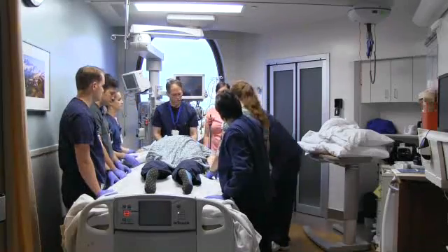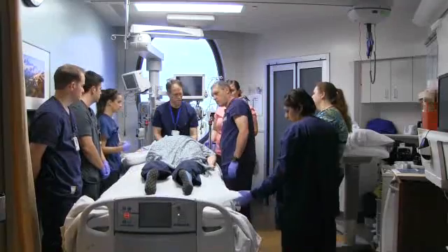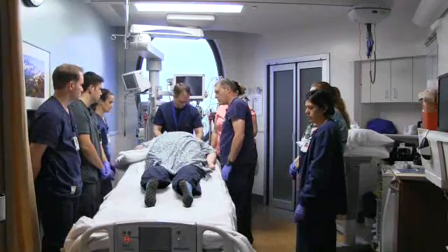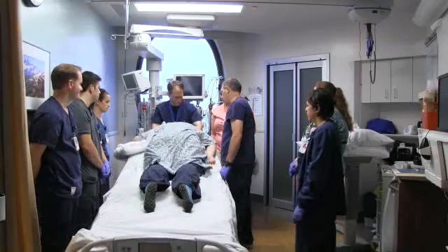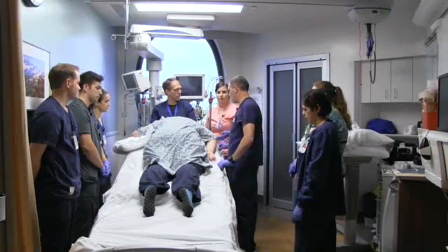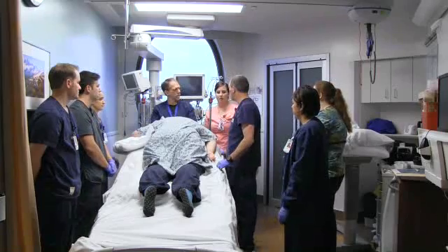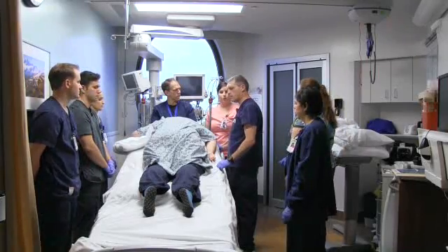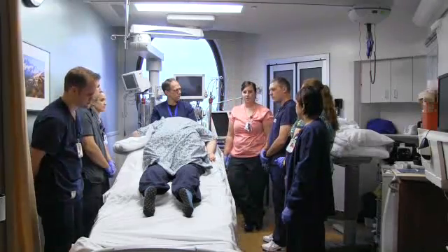The next step is to reverse Trendelenburg the bed. At this time, the patient will often slide down, so make sure RT stays at the head of the bed and you've got help just in case. Those are all the steps needed for the entire team, so the team can be dismissed to their other patients. The primary nurse and one other person then assist in making sure the patient is comfortable — all pressure points are floating, like the knees and toes, and everything is hooked up the way it needs to be.